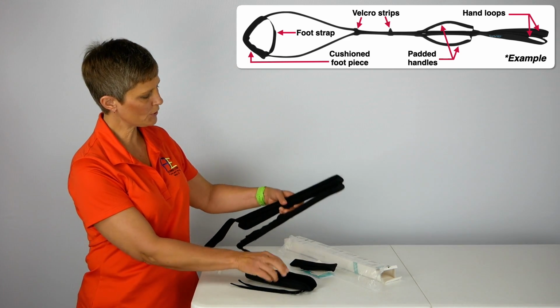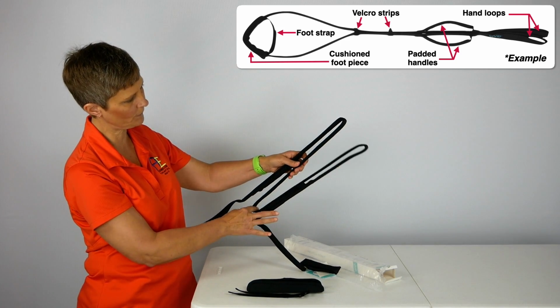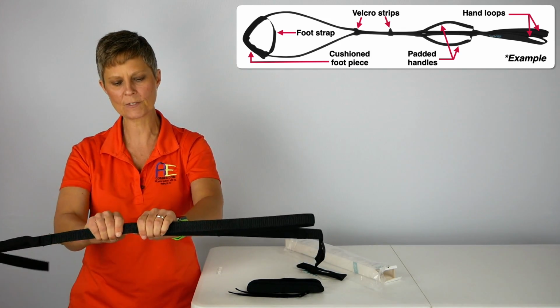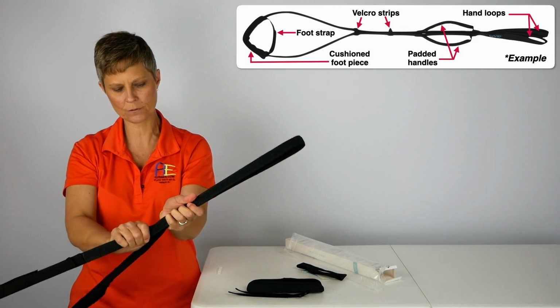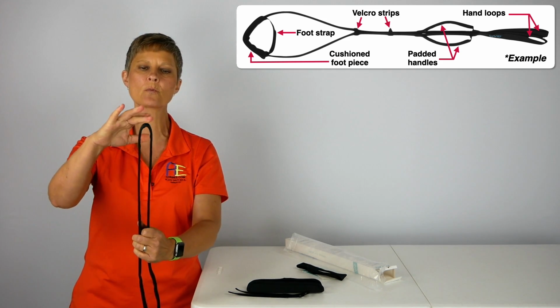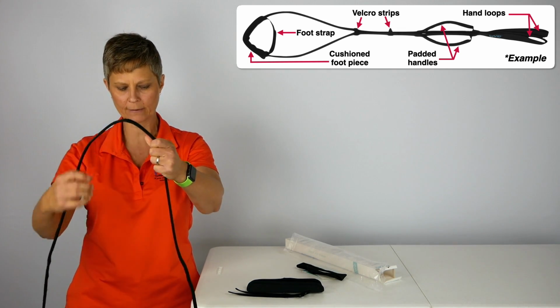All right, so the PROFLex strap is bent, so what I want you to do, you're going to straighten out the two sides. So this is where the foot piece is going to go, so you're going to straighten out these two sides. So we're just going to take it like this, and we're just going to straighten that out, just like that. So there's one side, and then we're going to turn it around and just straighten out this one. Good. And then there is the other side. Okay? So now this is where the foot piece is going to go. So we're going to widen this up just a little bit as well. All right? And just kind of bring it around like that.